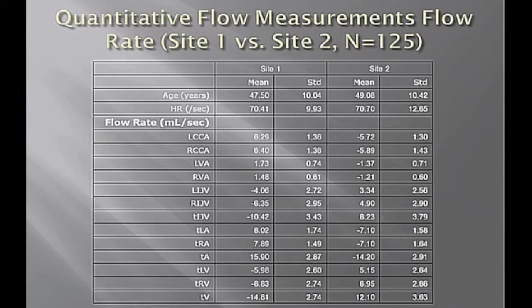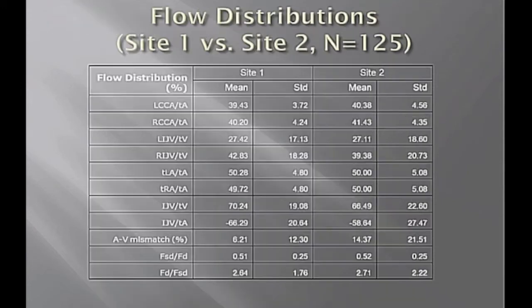So what people in ultrasound do, and what Dup did, was he normalized the venous flow to the total arterial flow. Well, that's a very nice idea, because that means as long as your flow measurements are consistent, even if you're wrong by a scale factor, you should get the same answers once you normalize that data. So this is a very robust way to do that.